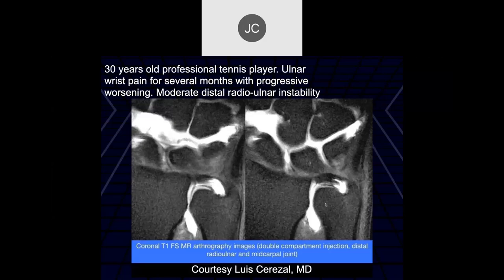Robert: we have a 30-year-old professional tennis player with ulnar wrist pain for several months, progressive worsening, and moderate distal radial ulnar instability. Here it looks like there's contrast at the foveal attachment. They did a double compartment injection — both the midcarpal and the distal radial ulnar joint space — and here you have basically an upper laminar tear; the lower laminar is still intact.